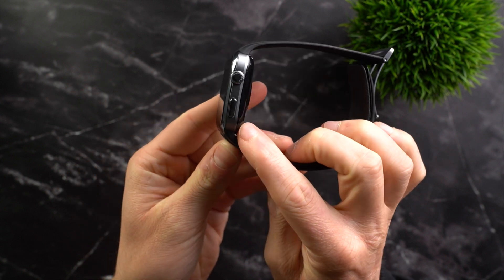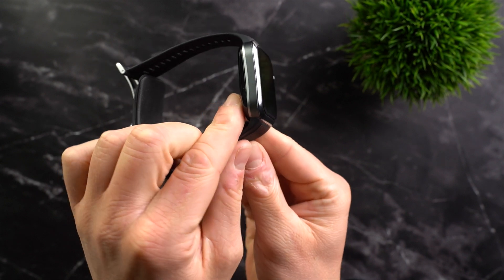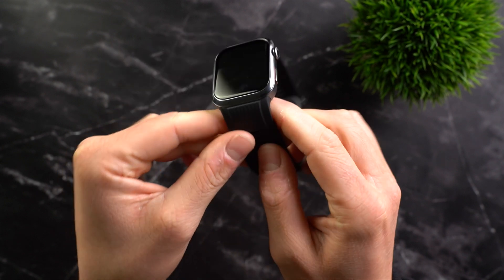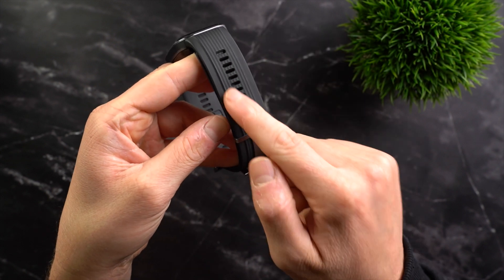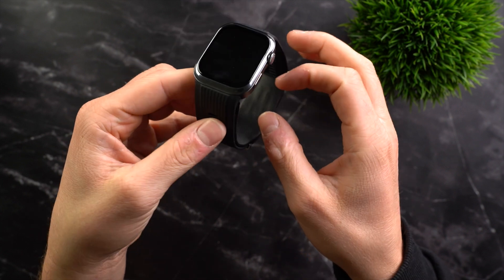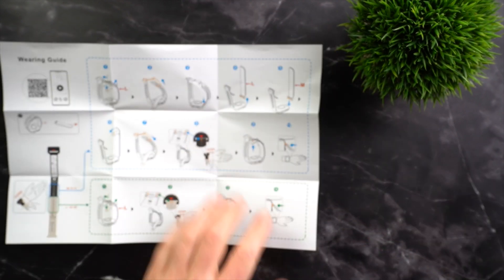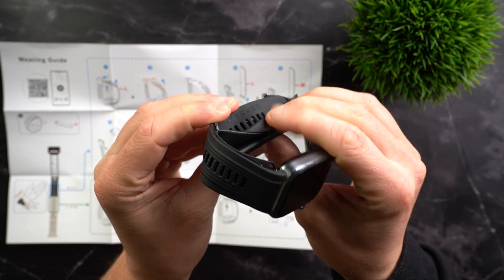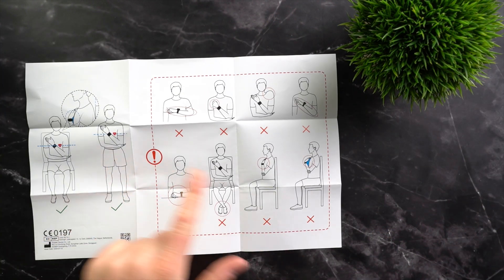With this watch, functionality takes precedence over comfort. In terms of materials, the watch is mostly made of aluminum, which is lightweight compared to stainless steel, helping prevent it from being heavier than it already is, while ensuring it is robust and high quality. The strap is made of Roro Elastomer in the black option, but there is also a gold option with a white leather strap. To ensure accurate blood pressure measurement, the strap must fit properly. You receive a leaflet with all the necessary information, and on the inside of the strap you'll find small numbers to help you adjust it correctly.